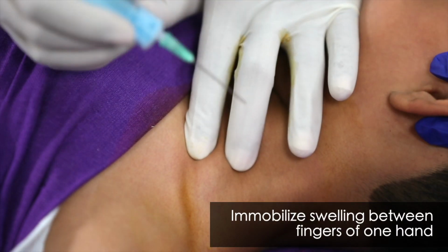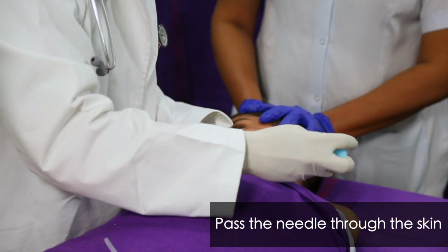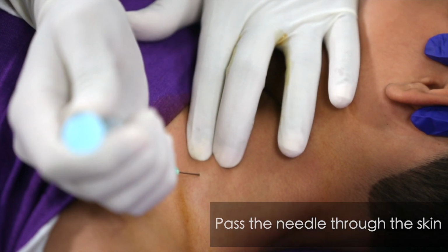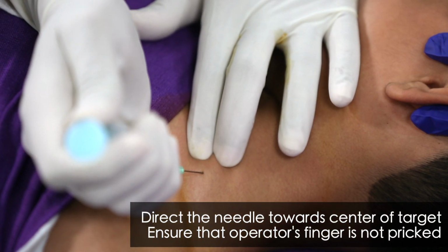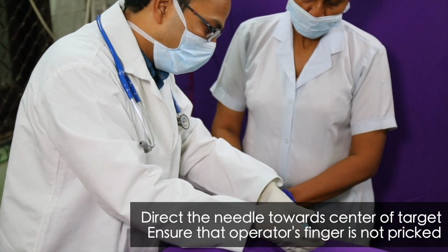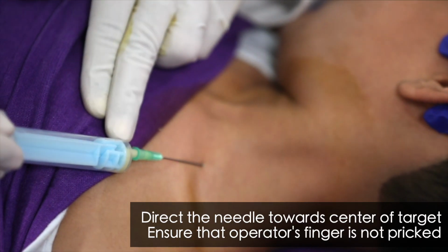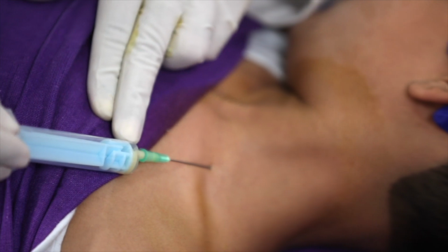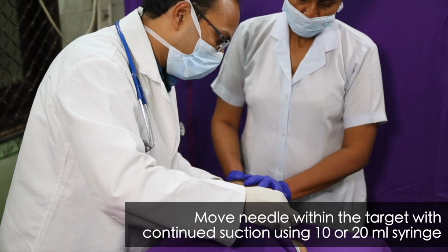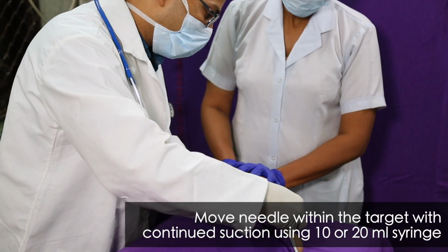The swelling or lymph node should be immobilized in between the fingers of one hand. Pass the needle through the skin, avoiding any superficial veins. Direct the needle towards the center of the target. Precautions must be taken to ensure that the needle tip is not pointing towards the operator's fingers, immobilizing the lymph node or deep structures below the node. Once in the target, the needle tip is moved within the target while applying suction using 10 or 20 ml syringe.